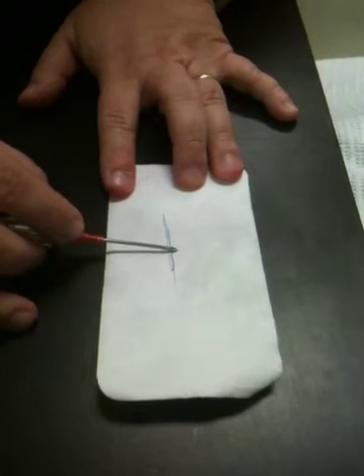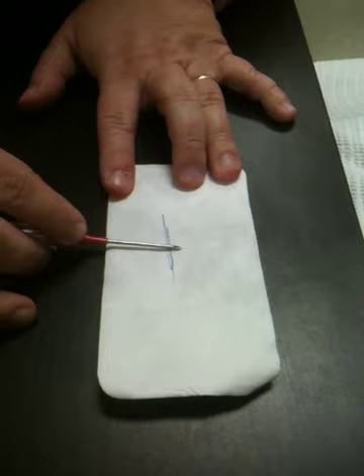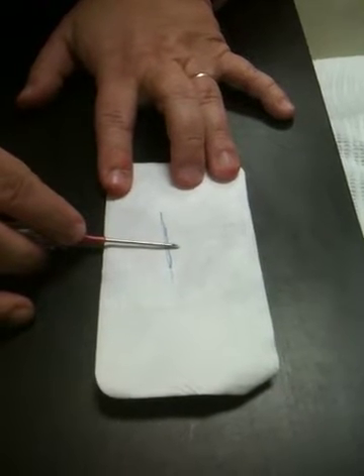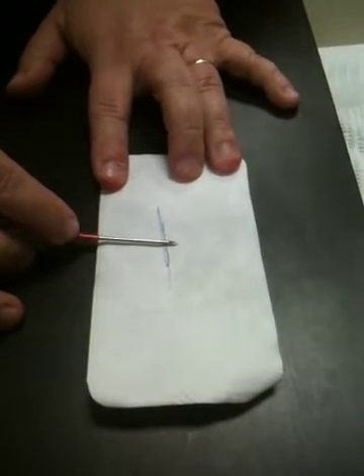So we've got it in. We've gotten flashback. We've got to go just that smidgen further to get that actual cannula seated within the vein.